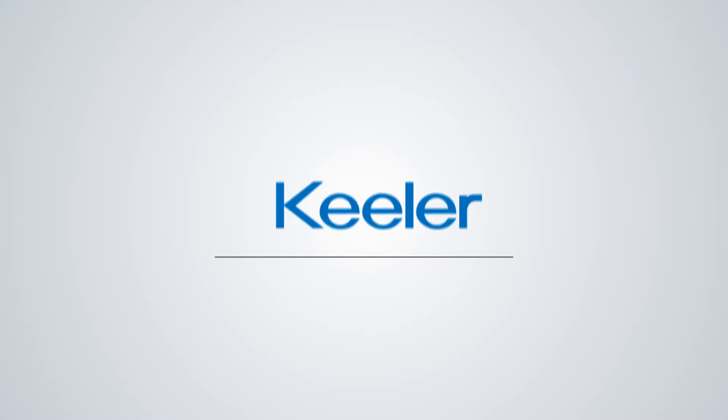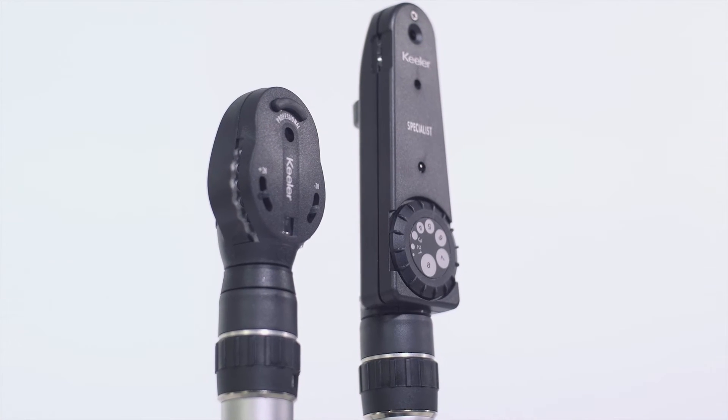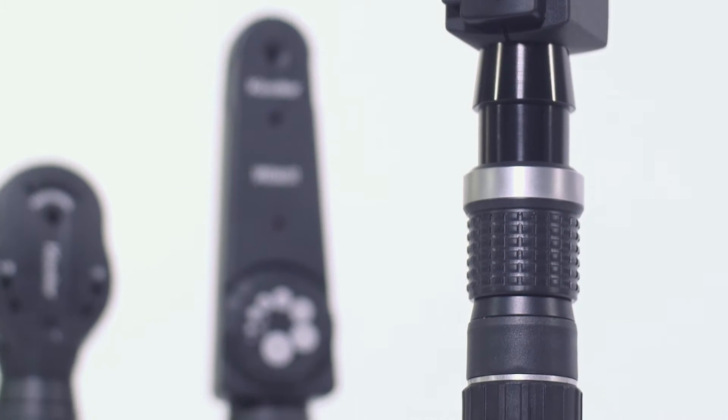Keeler offers a complete line of ergonomic, versatile, and precise handheld diagnostic instruments. This video will provide an overview of the features of Keeler's handheld ophthalmoscopes and retinoscopes, and a guide on how to use them.